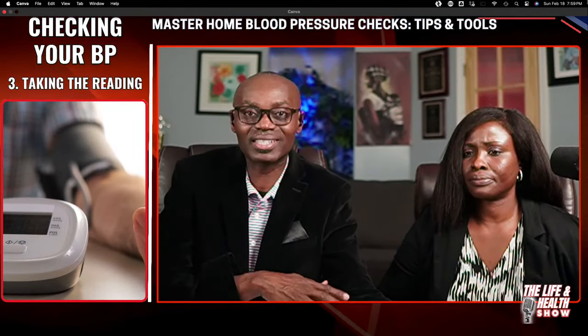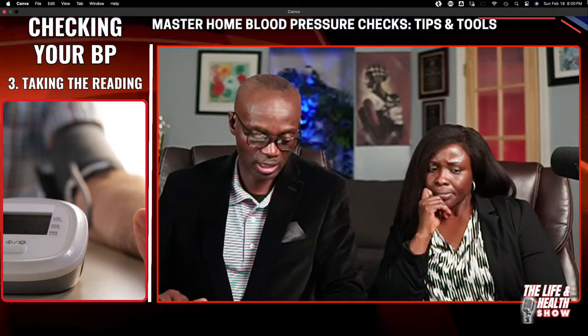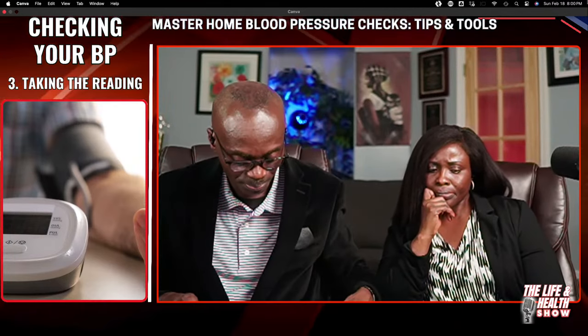The arm being on a flat surface, you being on a chair that supports your back, your elbow part being in line with your heart, not too low, not too high, and being comfortable. Kind of like what this picture shows with the man that we are seeing. And that is what we are talking about. Is there any other thing that we could tell?